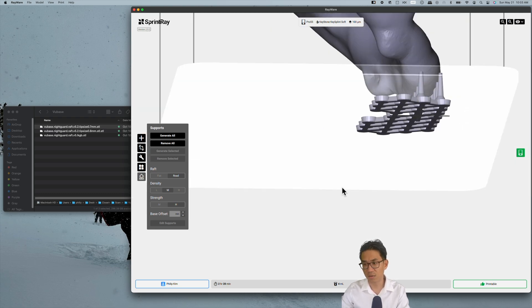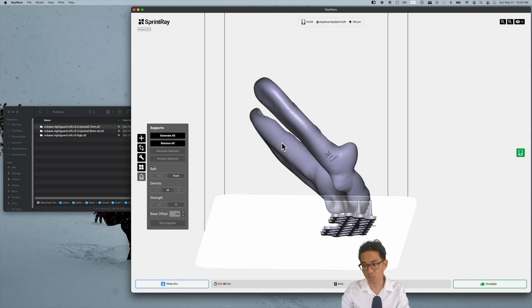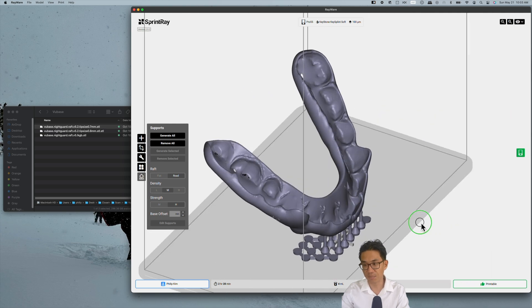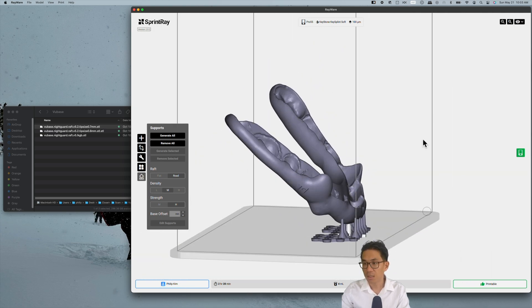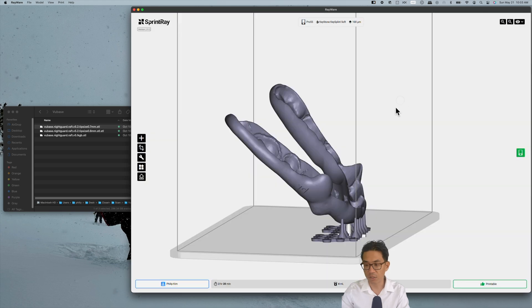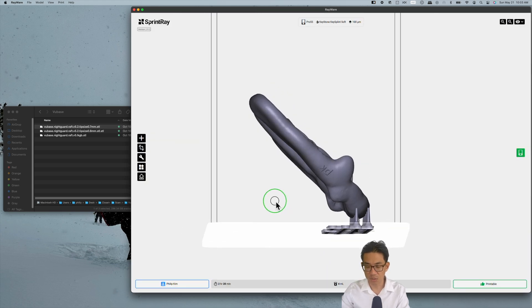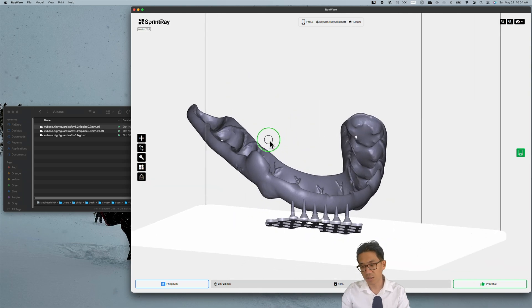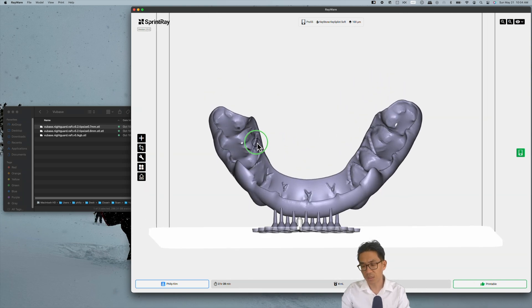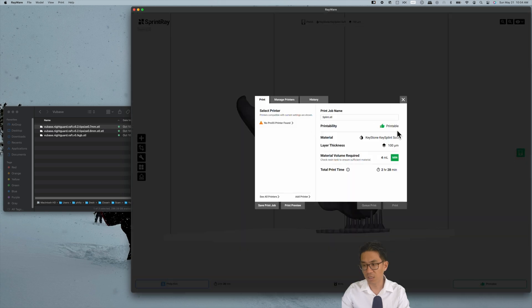It takes another hour longer, so two and a half hours. However, that's just machine time. You just print it and leave it. From here you can just hit print, and with KeySplint Soft, it takes about four mils of resin to get your night guard.